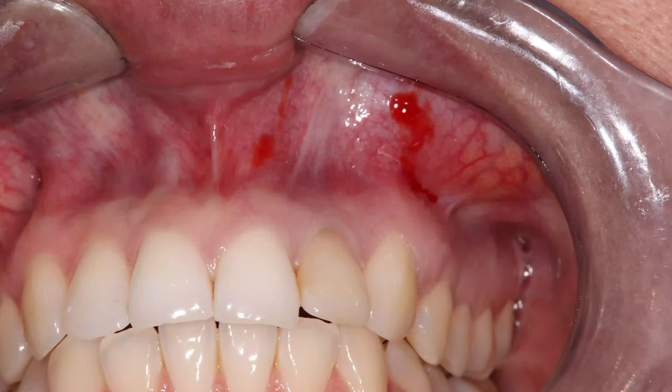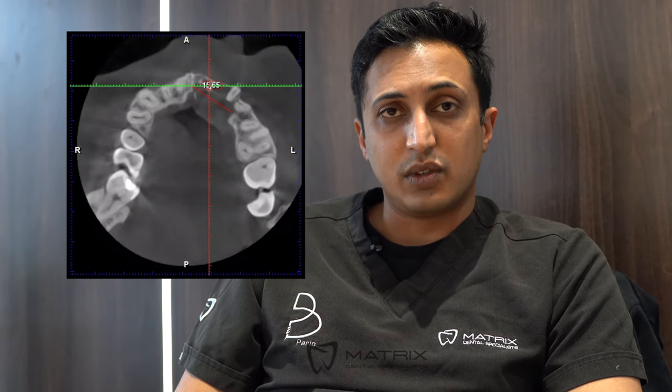In this case the lesion was quite large and extensive, extending through the bone into the tissue of the palate, so we selected the surgical option. The surgical option involved the dentist completing the root canal — opening up into the center of the tooth, removing all the contents of the nerve chamber, completely sterilizing and decontaminating the tooth, and sealing it. On the same day, we opened up a surgical flap and exposed the large lesion.